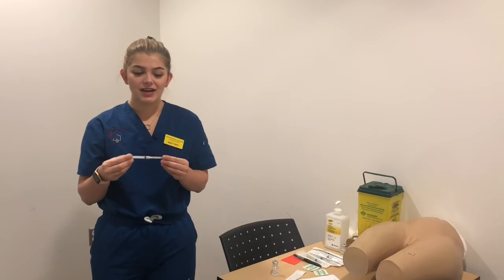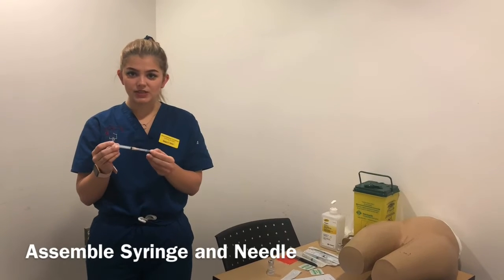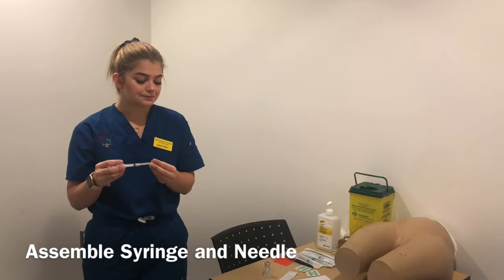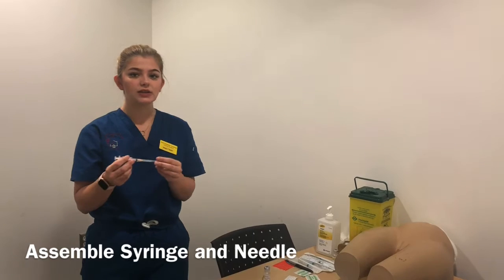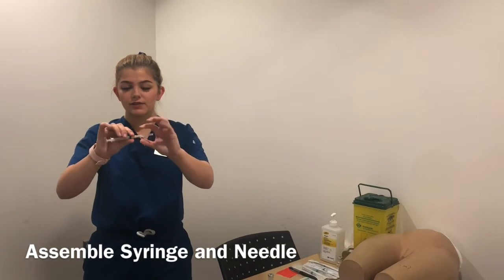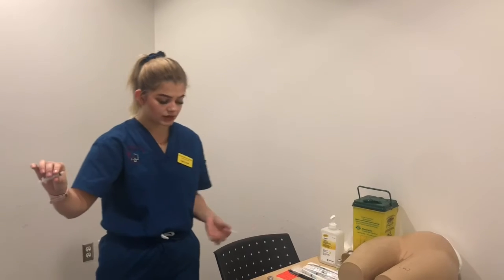Okay, so after alcohol swabbing the top of the vial, you want to grab your needle from the packaging. Usually this one already came assembled. If it didn't, you would have to assemble it with the correct gauge and needle length, and when I'm drawing up, I want to make sure I'm using a blunt needle, and then you can change the needle tip out later. So when you're taking off this cover that protects the needle, you want to pull it out away from you so you don't injure yourself.